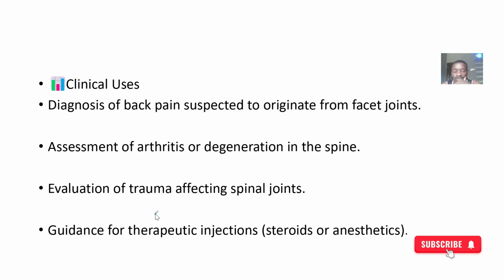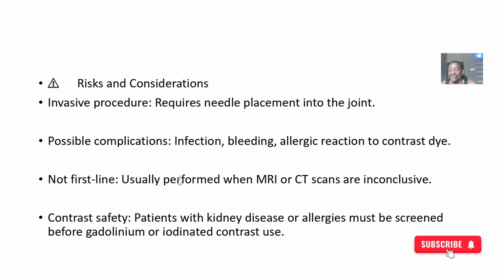Okay, so clinical uses: to diagnose back pain. What is the cause of back pain? Assessment for what? Arthritis, degeneration in the spine, evaluation of trauma affecting spinal joints, and guidance for what? Injection. Sometimes you want to give an injection there.